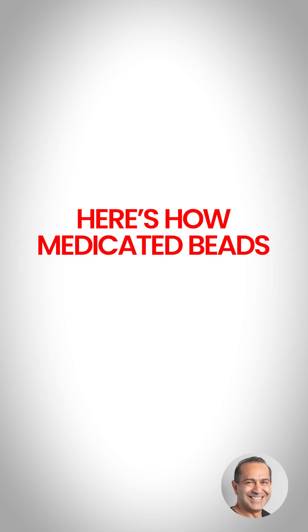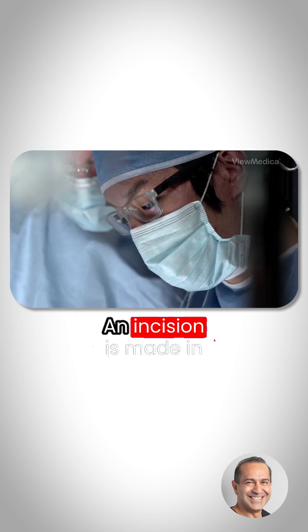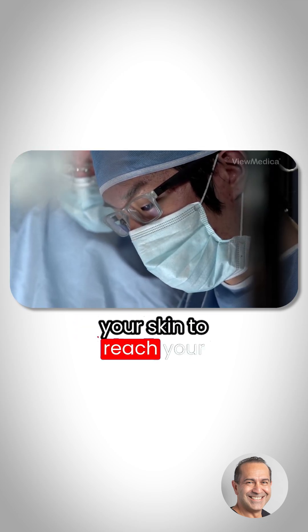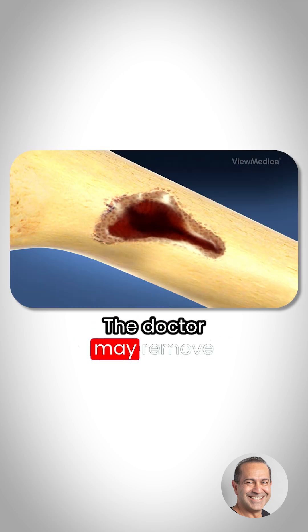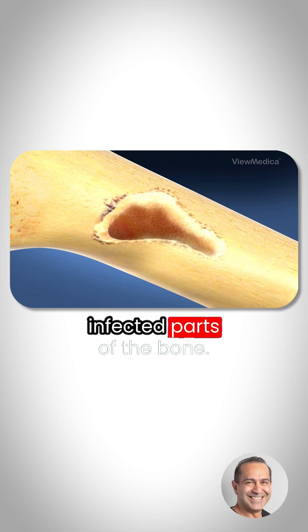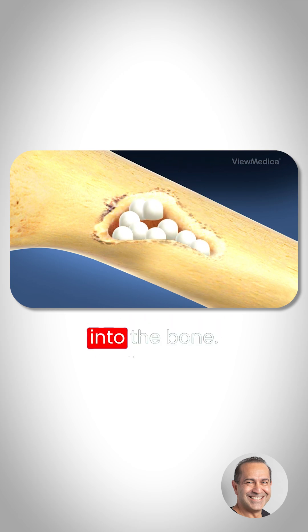Here's how medicated beads are implanted. To start, you're given medicine to put you to sleep. An incision is made in your skin to reach your infected bone. The infected area is cleaned, and the doctor may remove infected parts of the bone. Then the beads are packed into the bone.